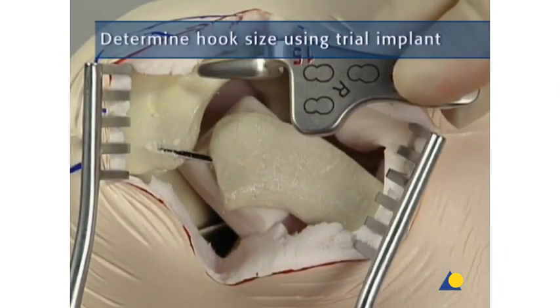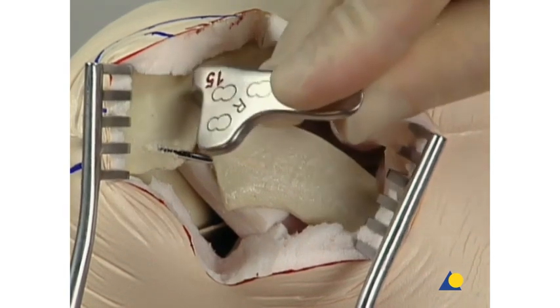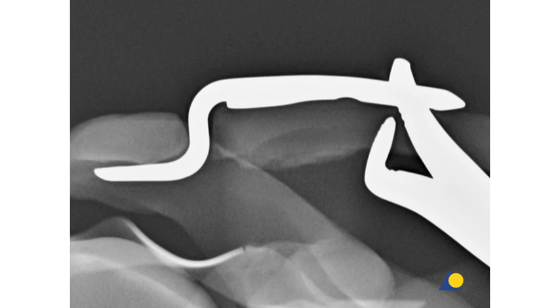Trial implants are provided to help select the proper hook size. In this case, the trial implant with a 15 mm hook is used to demonstrate the technique. In the clinical situation, the choice of the trial implant should take into account the size of the patient. The hook of the trial implant is passed under the acromion and the shaft of the trial implant is placed on the superior aspect of the clavicle. If it is difficult to lower the shaft onto the clavicle, then an implant with a larger trial hook should be used. An intraoperative x-ray control is made to verify that the hook size is correct.